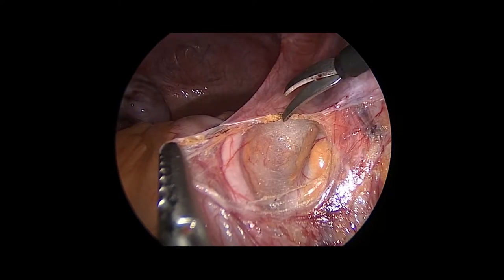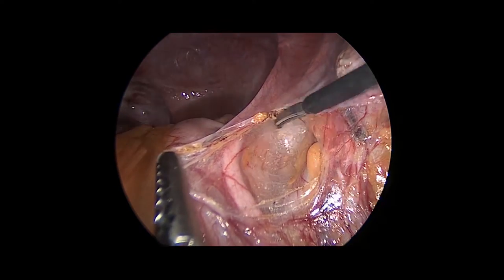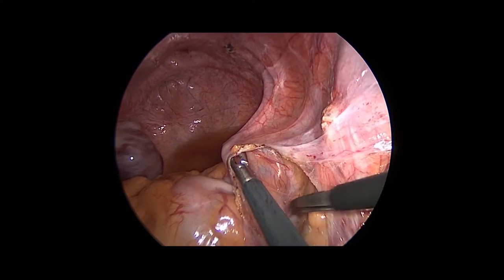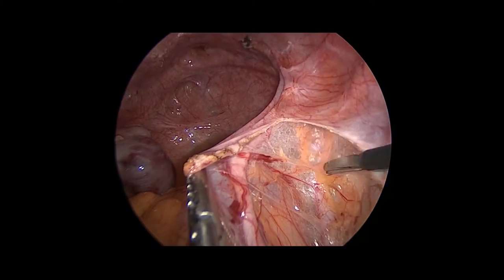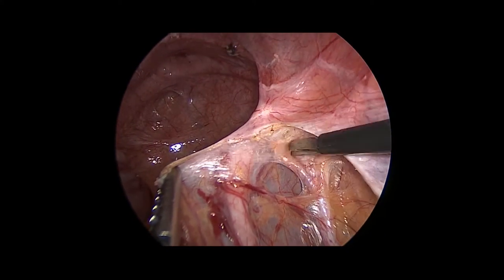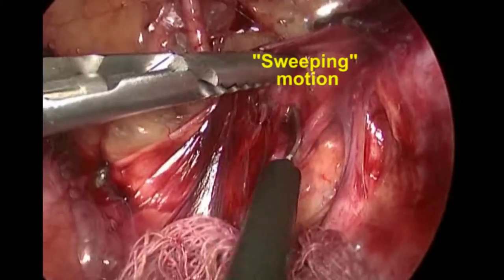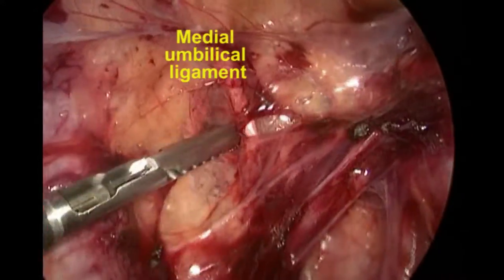The paravesical space is lateral to the bladder and separated from the pararectal space by the cardinal ligament posteriorly. The peritoneum overlying the medial umbilical ligament can be incised with monopolar energy to gain access to the paravesical space. Alternatively, as shown here, both the paravesical and pararectal spaces can be entered by starting the peritoneal incision at the level of the round ligament. The uterine artery, which divides the paravesical and pararectal space, is skeletonized using a combination of sweeping and push-spread maneuvers.